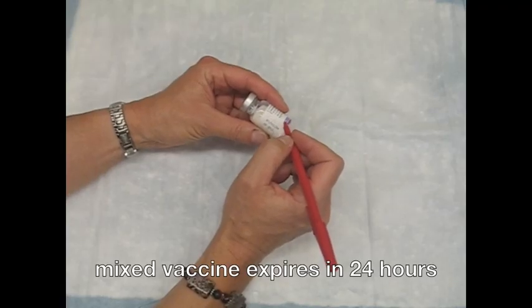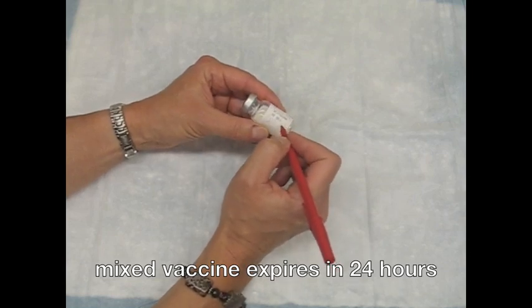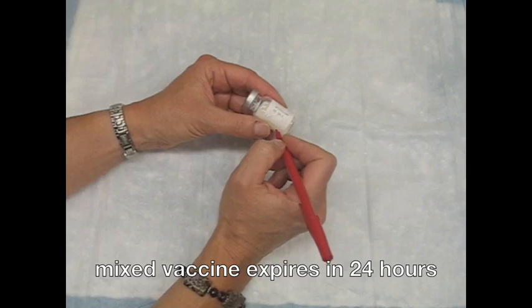Once mixed, unused vaccine will expire in 24 hours. Mark the vial with the time, date, and the lot number from the outer packaging.